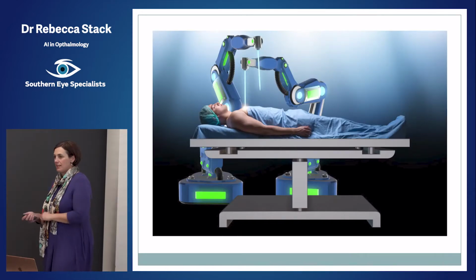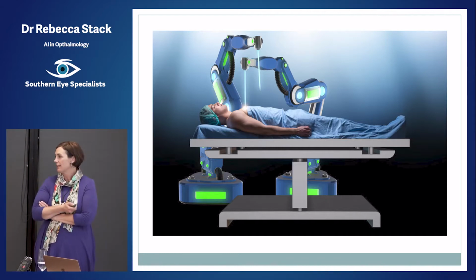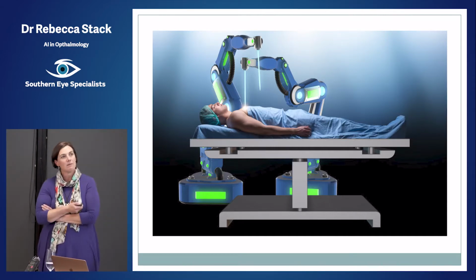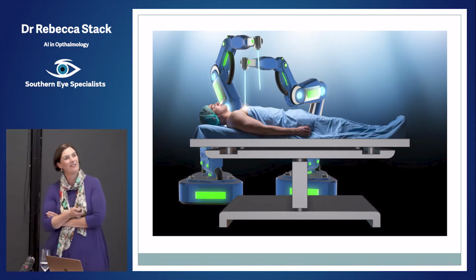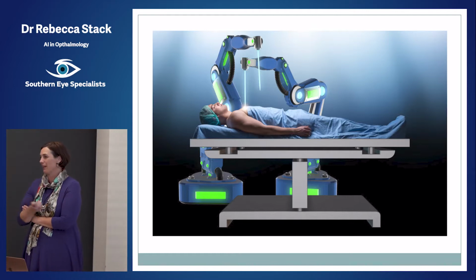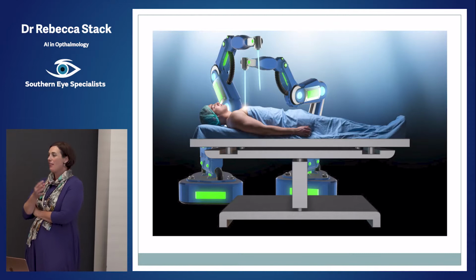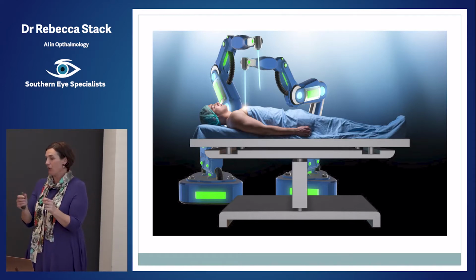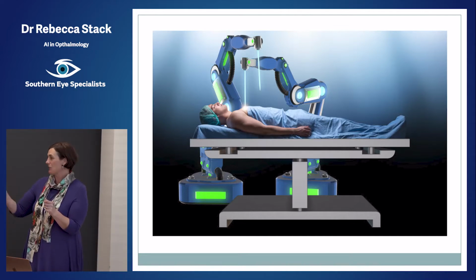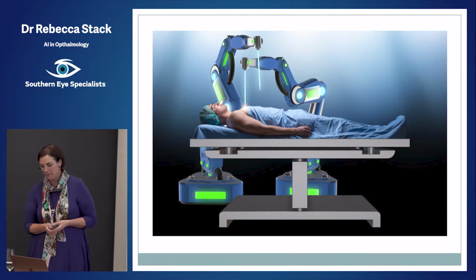Then there's autonomous robotic surgery. So this is when we let robots make the decisions and do the surgery themselves. So I'm not sure that we're ever going to get to this sci-fi kind of world where there's no one in the operating theatre apart from the patient and the robot. But you can imagine that this is not that far away. They've already got robots that can manipulate soft tissue and close wounds by putting in sutures, all on their own, without any kind of human interaction. And these are being used in clinical trials.